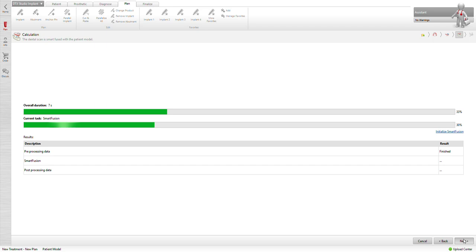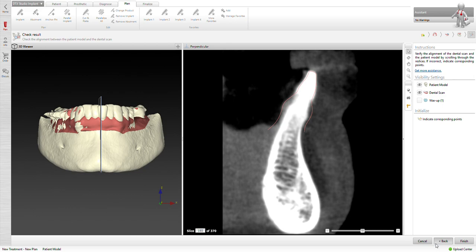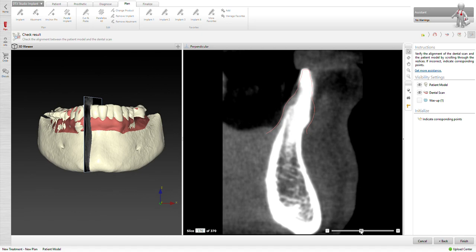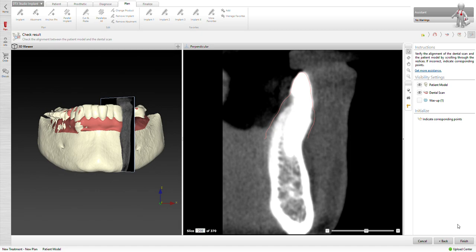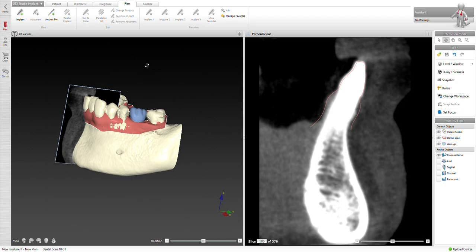And then we hit next, and now Smart Fusion is merging the two files together. Once it's merged together, we're going to go ahead and check the accuracy to make sure that it's merged and it matches up. You're simply going to move the reslice curve around or reslice rectangle. Yeah, it looks pretty good.